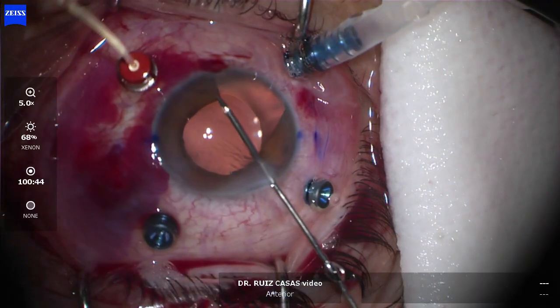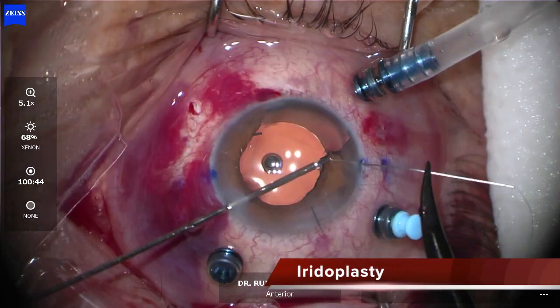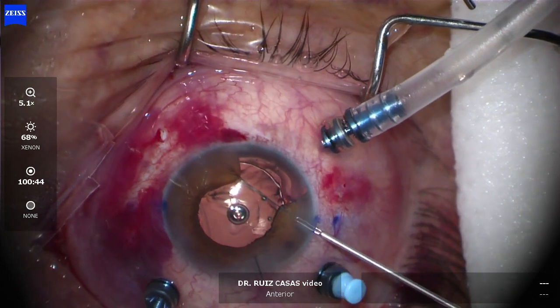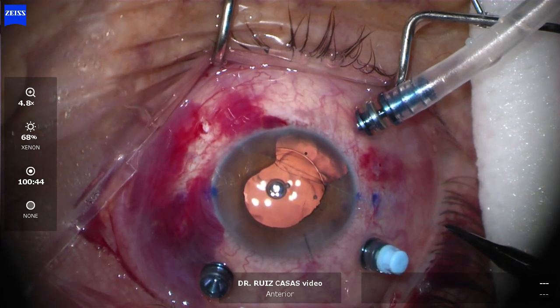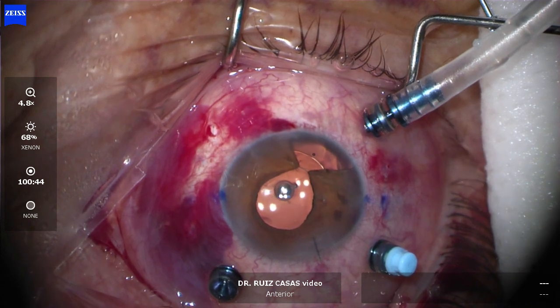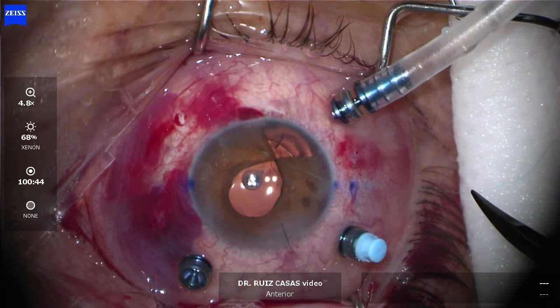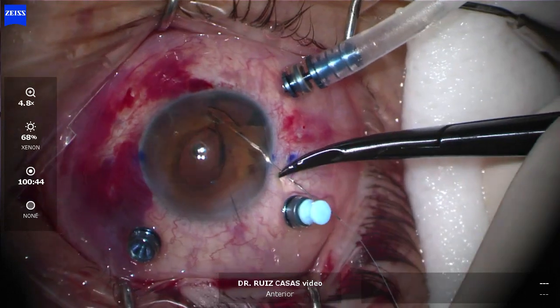Now I'm confident the lens is stable, so I'm going to fix the iris defect with the Siepser suture. The problem with the Siepser suture is you can get engaged into the sclera, so I pass the needle through the gap of the ILM forceps and use the forceps to recover the loop of the 10-0 nylon to tie the knot. I'm suturing the iris and closing the gap very gently, paying attention to the iris periphery to avoid creating an iridodialysis. Now I'm fixing and cutting the suture and placing another stitch.